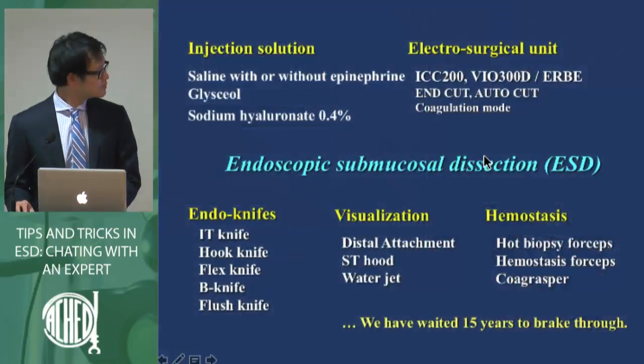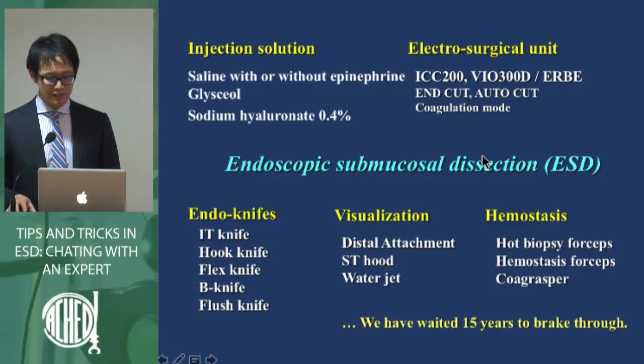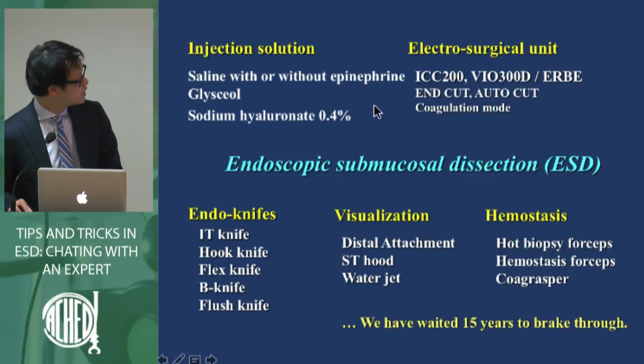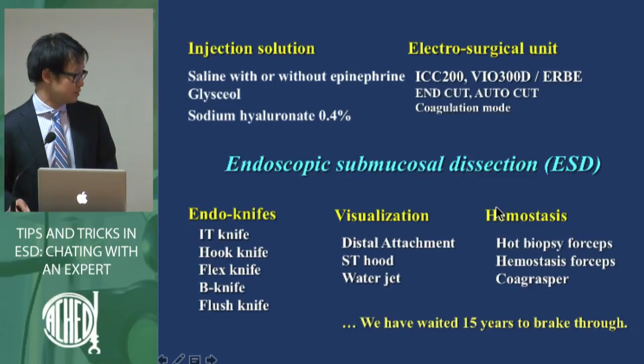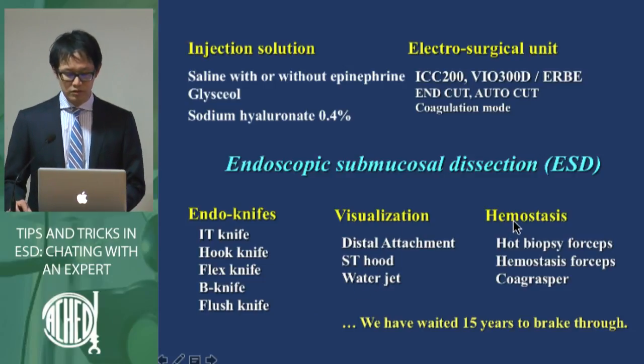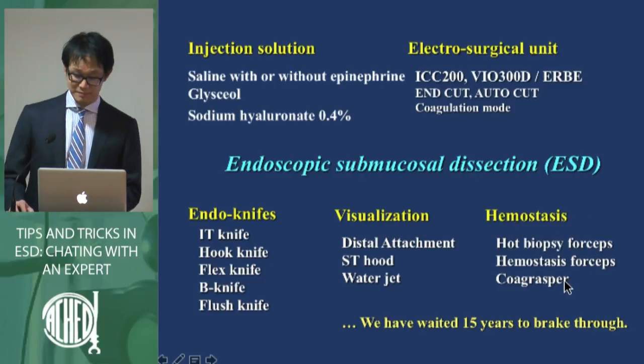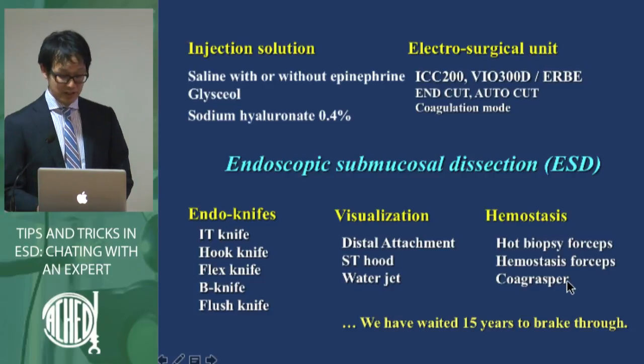ESD has developed through many innovations: for example, injection solutions, electrosurgical units and endo knives, visualization such as the distal attachment, the water jet and injection needles, and also hemostatic forceps and equipment for hemostasis.